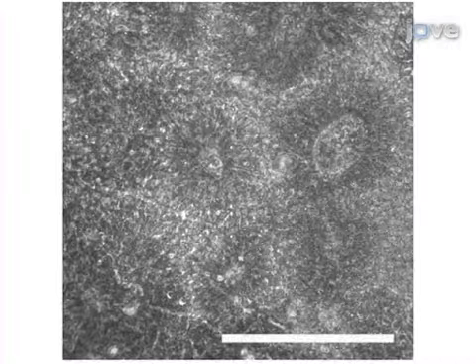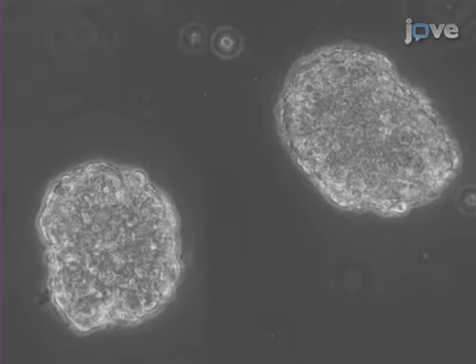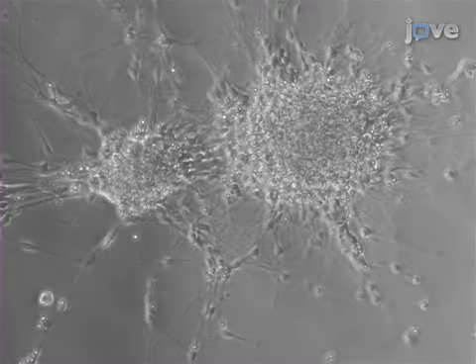Next, embryoid bodies, or PSC aggregates, are allowed to attach onto tissue culture treated plates, where the cells expand and differentiate into a monolayer with the centers forming neuroepithelial cells morphologically similar to columnar cells. Next, the neuroepithelial cells are isolated and placed in suspension cultures where they form neurospheres. Finally, the neurospheres are plated onto coverslips where they can further differentiate.